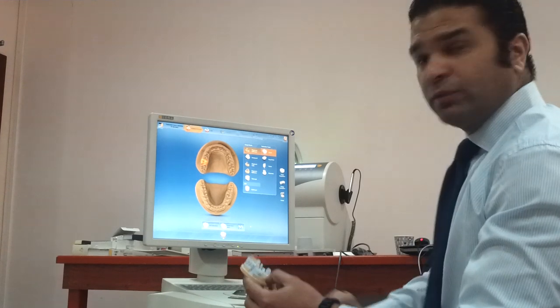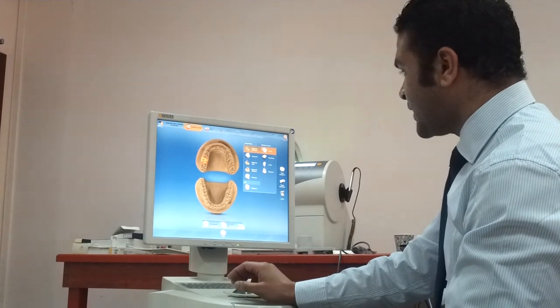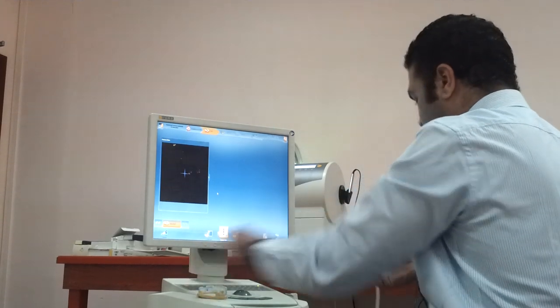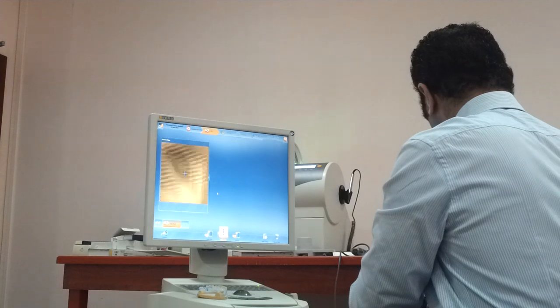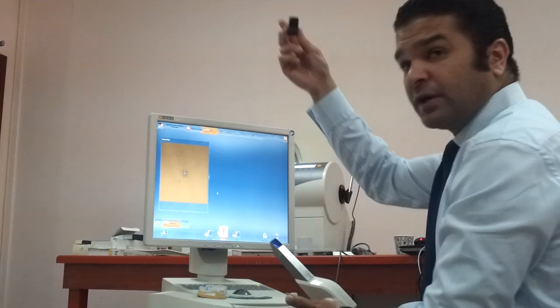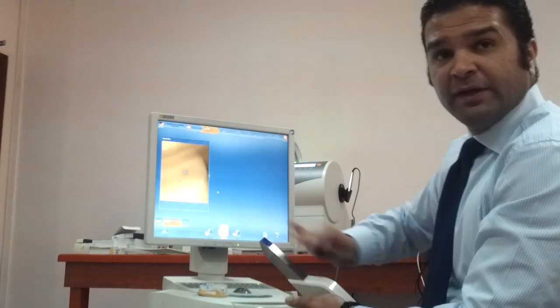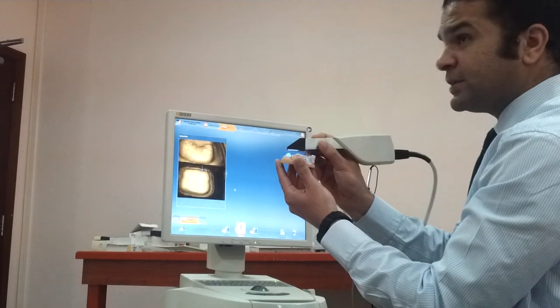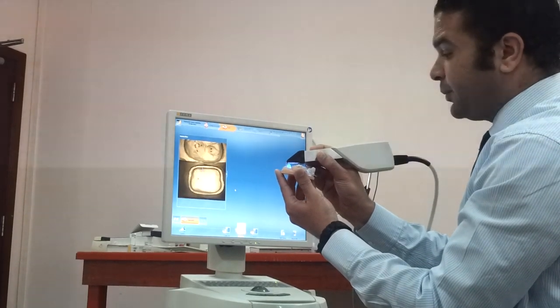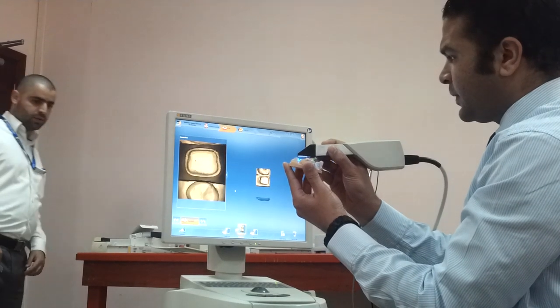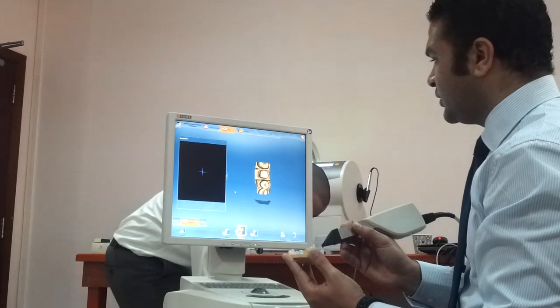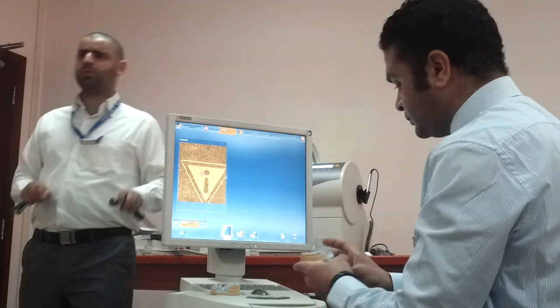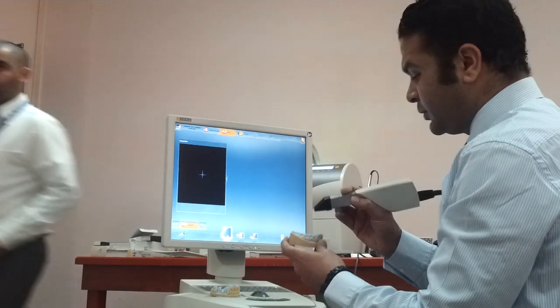Now my crown is administrated. I'll press next — this will be my optical impression camera, which I introduce inside the patient's mouth. The tips are autoclavable between patients, and you can chemically wipe the camera before taking an impression. I move my camera like a handpiece, keeping the tip toward the distal part, and simply take my shot. I don't need rubber-based or any physical impressions. Now I'll switch to the lower jaw and take my shot.